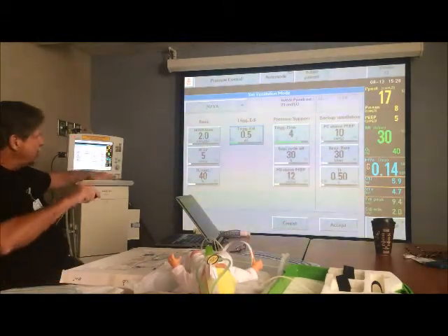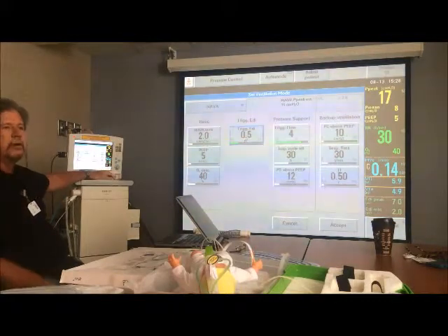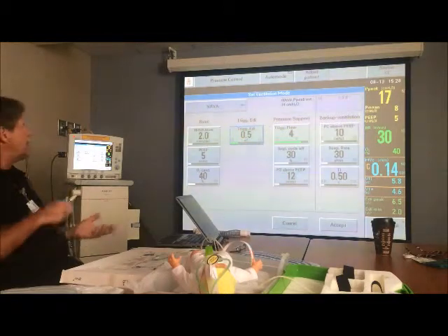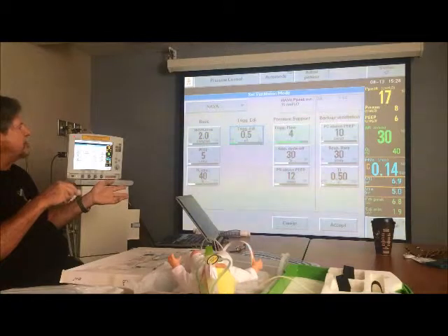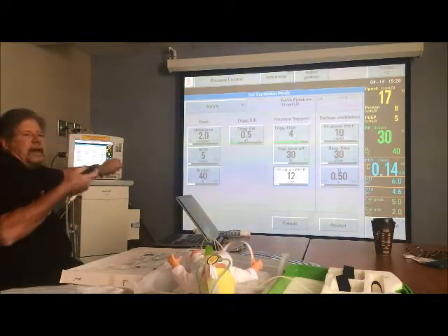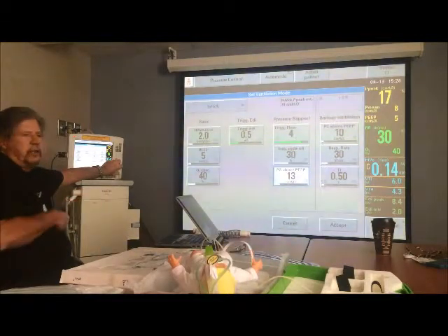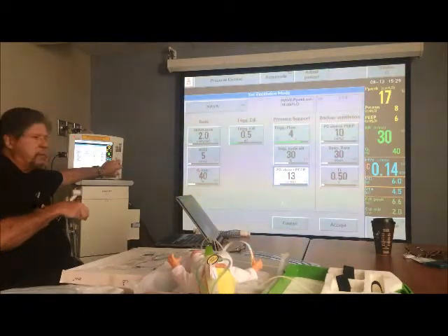Now the next row of buttons is the simplified explanation for in the event that we lose our catheter, that it comes out. The baby is still breathing, still triggering the ventilator, but instead of getting the NAVA breaths, he's simply going to get plain old-fashioned pressure support breaths, of whatever you set. So if we lost the catheter, we'll deliver the same pressure support as he's currently getting, and we'll cycle off at 30%. This is just plain pressure support.